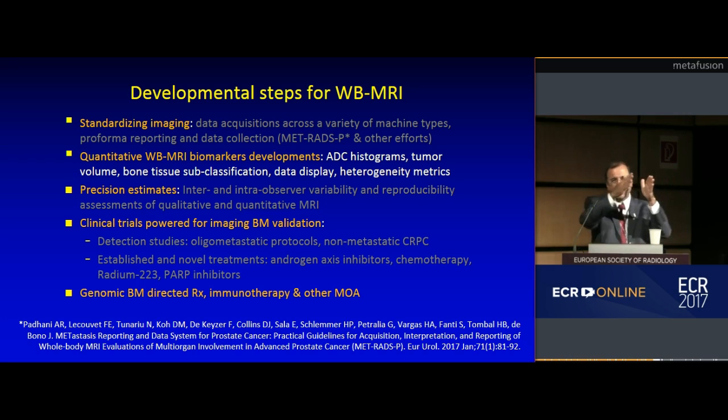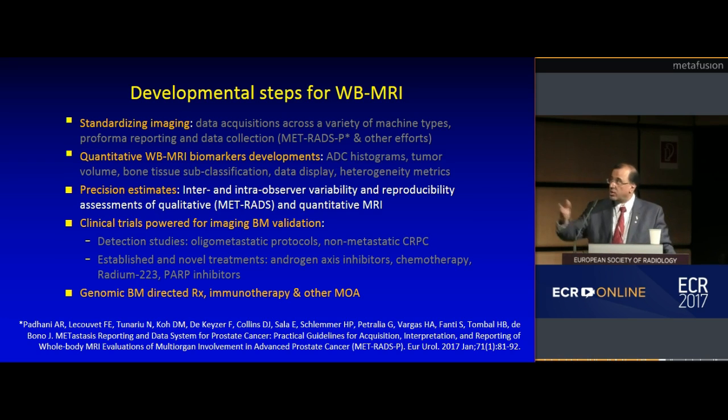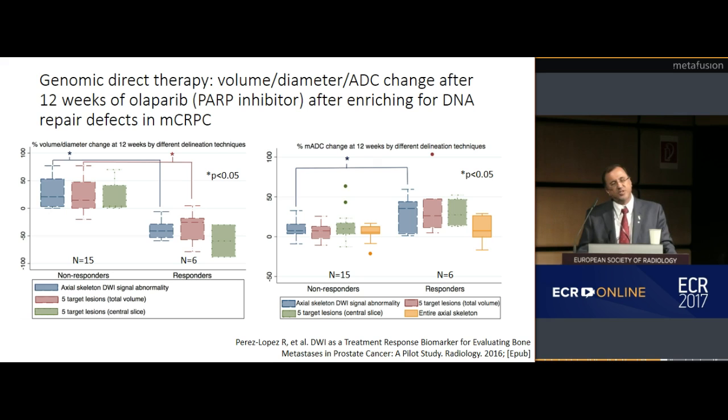So as you move in this direction into what we are now calling next generation imaging, you will have to get used to histograms and displays like the one I've shown you, but this is a direction of travel that you guys will need to think about as you go forward, okay? Now, if you think this isn't the way forward, look at this paper that was published in Radiology recently, looking at changes in ADC after using a novel new method of treatment of prostate cancer.